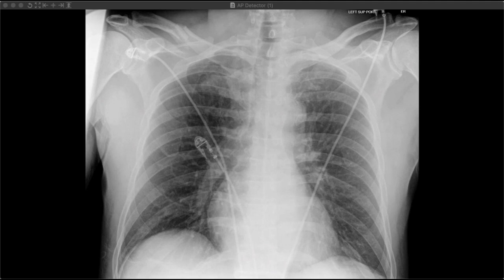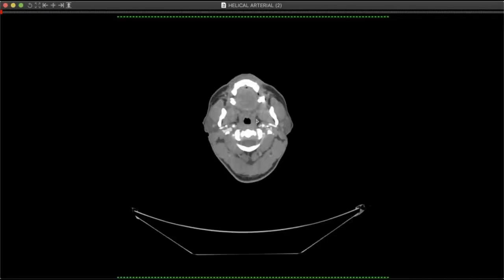And the radiograph shows not much, there's a little bit of an apical cap up here. And maybe on close inspection, you may see a little defect in the rib, but that's a tough spot because there's often a gap there. You see he's got a clavicle fracture as well. But this little apical cap. And one wonders if the trachea is slightly displaced.